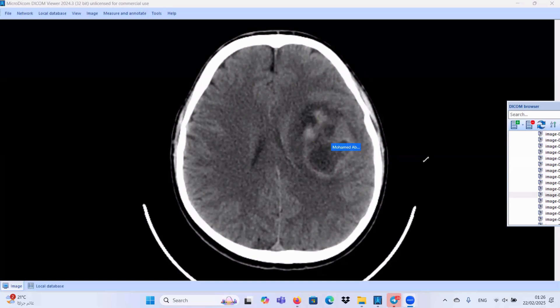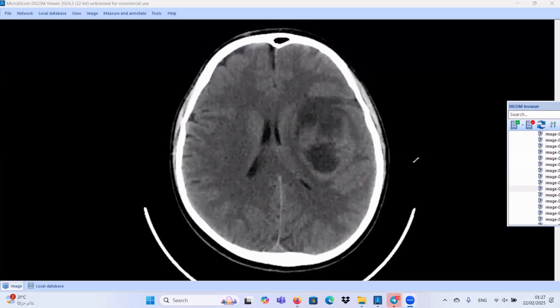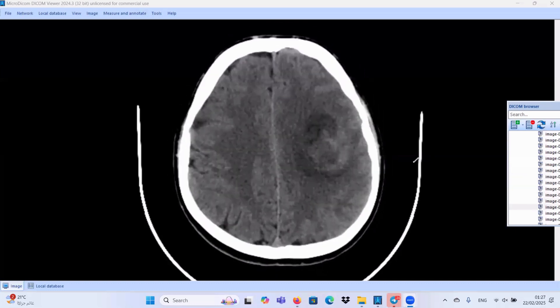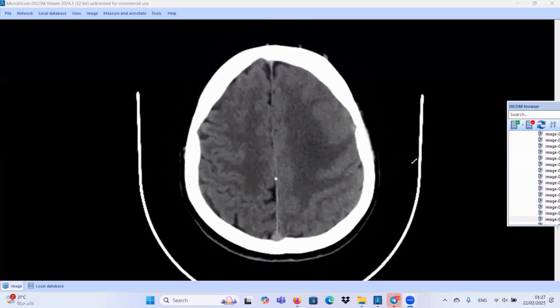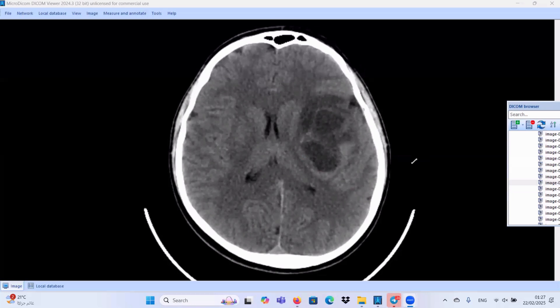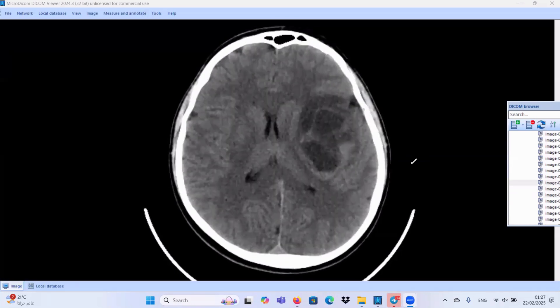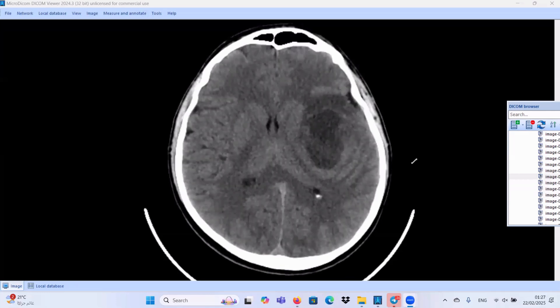These hyperdense components may be hemorrhagic or may be proteinaceous. So, we are dealing with a complex mass lesion at the left basal ganglia region, extending superiorly to the centrum semi-oval and extending to the left frontal region. This lesion exerts mass effect in the form of compression of the left lateral ventricle with mild midline shift.